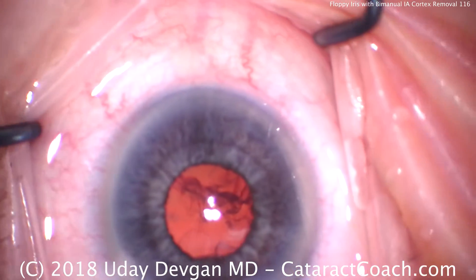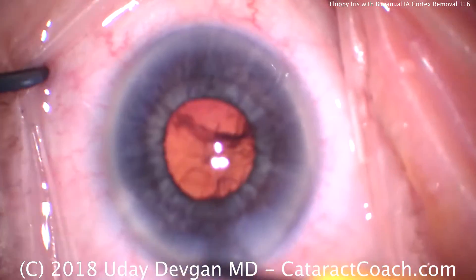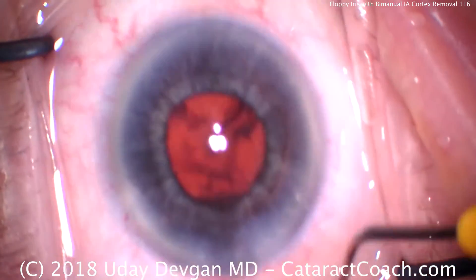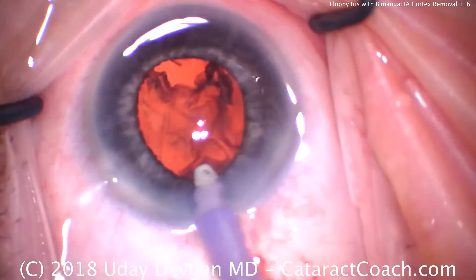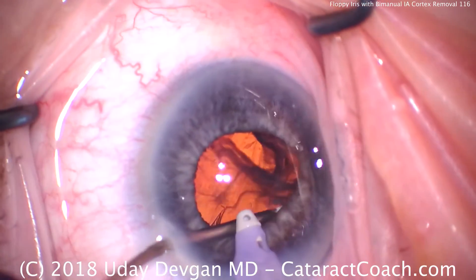Hard to get access, so what we can do is switch hands. We can put the piece back together. Actually, we're going to make some incisions here — we're fenestrating the conjunctiva because we're getting some chemosis. Just taking a little break there. Now let's go back in the eye again. This is the beauty of watching unedited video — you get to see all these steps.